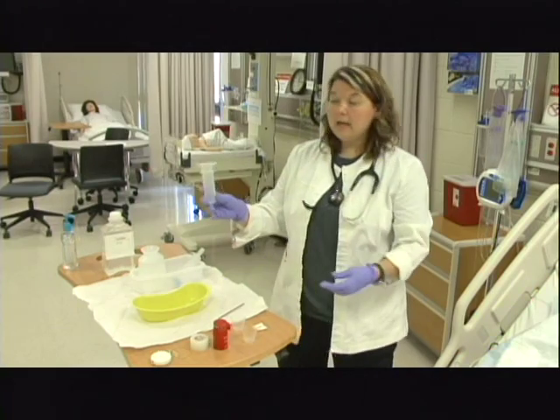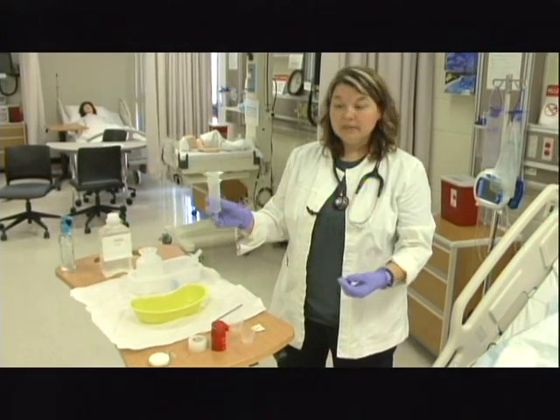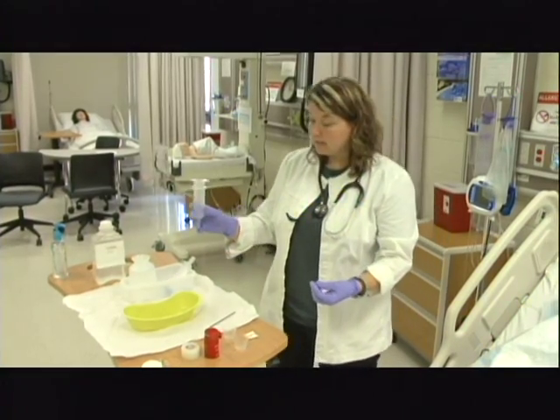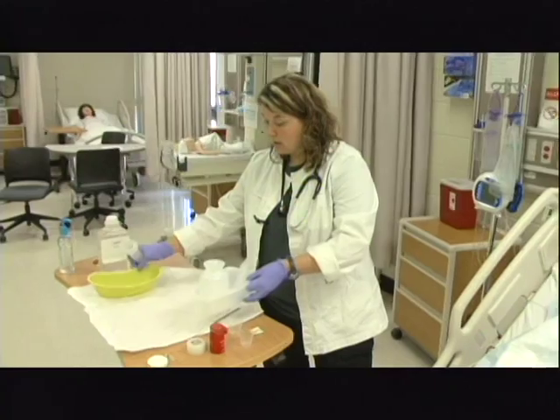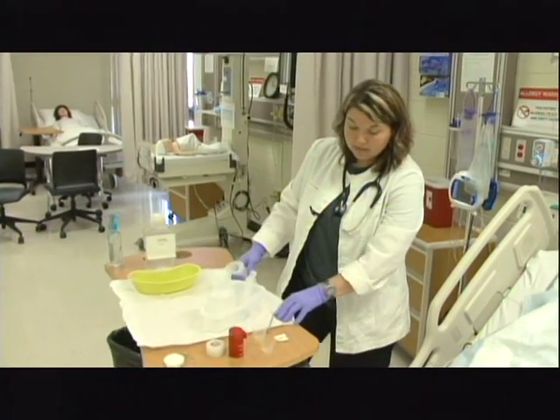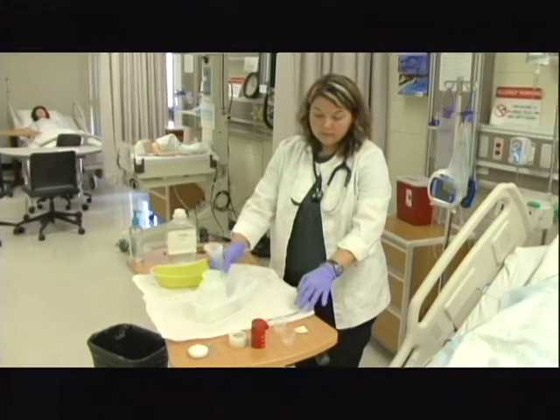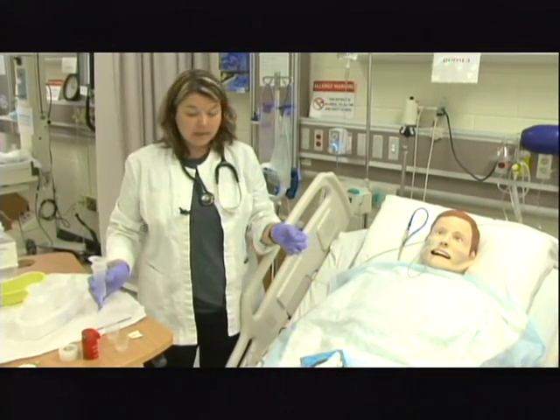that out, and actually this is going to be attached for what we call free flow. This is the best and most appropriate way to give your medications. So I'm going to move this stuff around a little bit to make sure I have what I need closer. I'm going to move my table up here closer to my patient. I have already confirmed placement of the tube, and you must always do that before you administer medications.